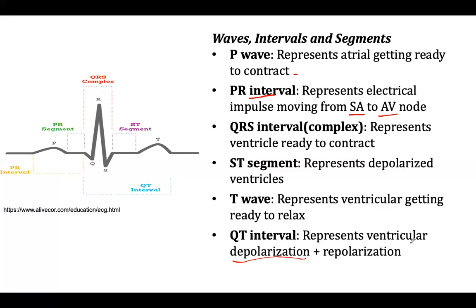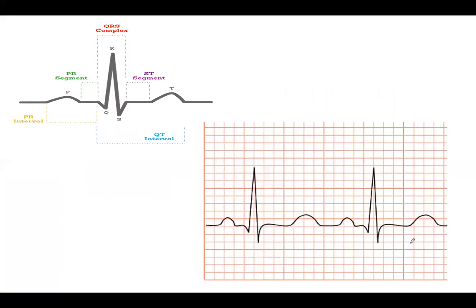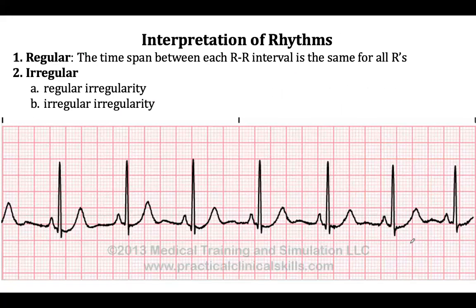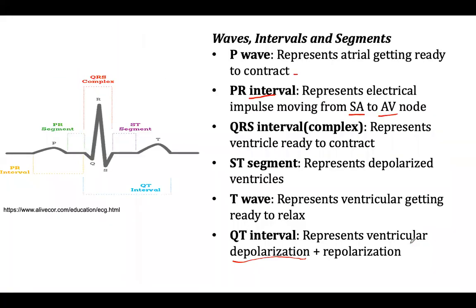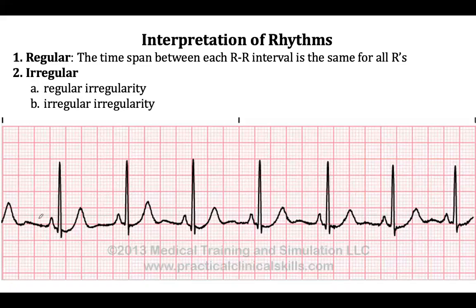Now, in terms of what we want to study on your ECG, we have what we identify as 5 cardinal rules. I've listed them as individual slides. So one is interpretation of the rhythm. I'll go over it and then we'll go over the example. Is your rhythm regular? As in, are your R to R intervals the same?